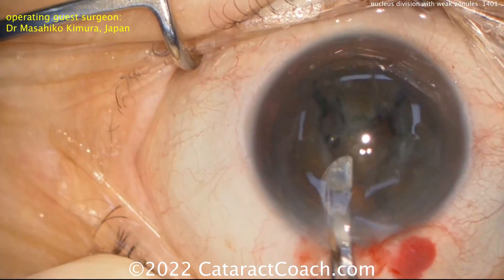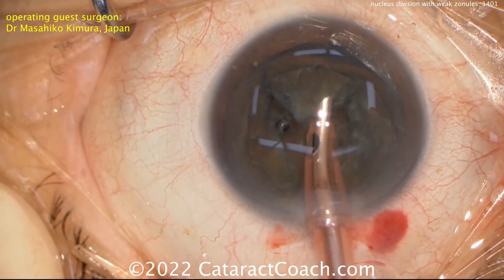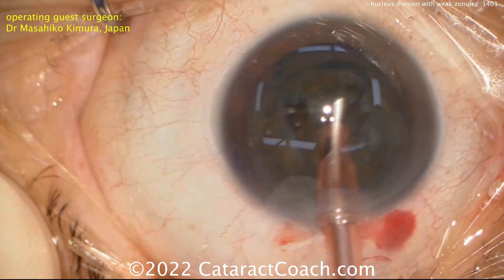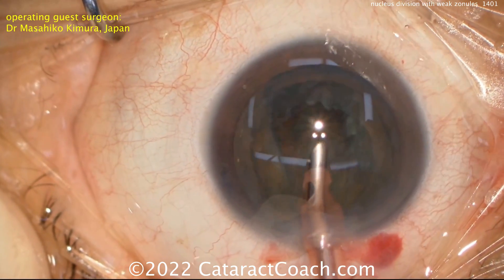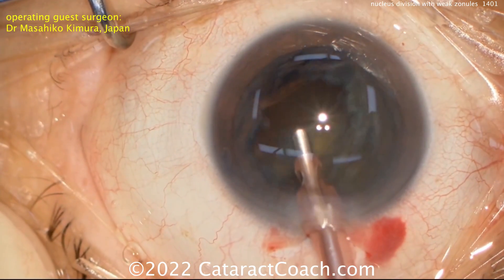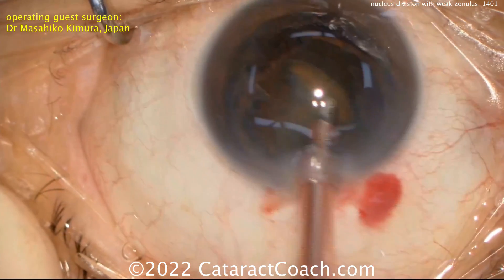Now you've got three pieces in the eye, and those can be emulsified. First, coming out with that central piece — once that central piece of nucleus is removed, it'll debulk it and there's a lot more working room. Now each of the two side pieces can be brought up and emulsified.